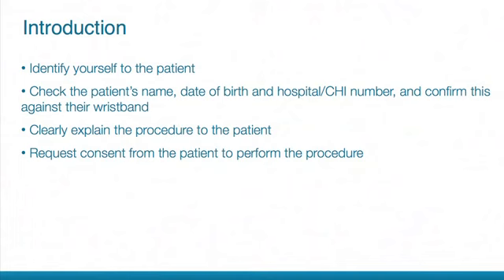Before commencing the procedure, identify yourself to the patient. Check the patient's name, date of birth, and hospital or community health index number and confirm this against their wristband. Clearly explain the procedure to the patient and request consent before continuing.